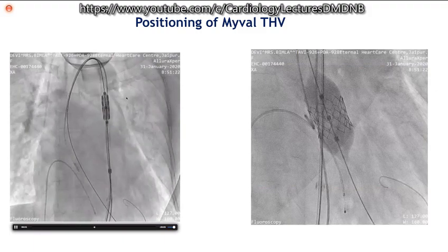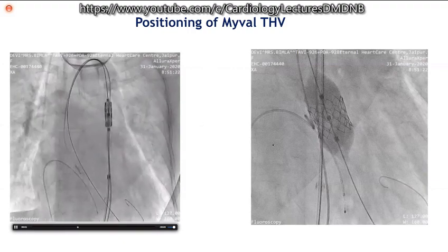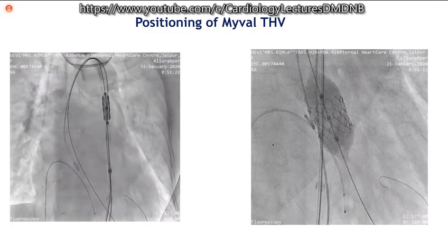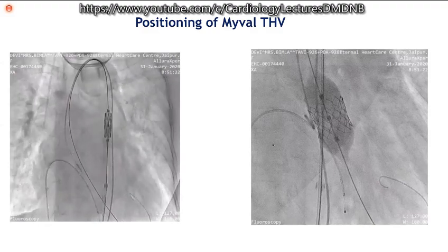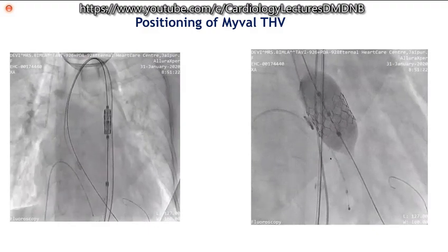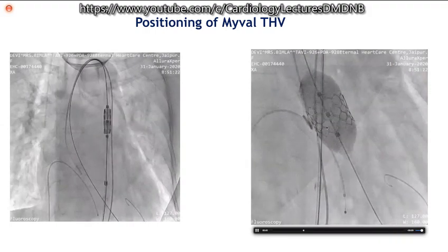This was already discussed in the previous cases as well. Use the Navigator system. So the way to position the Myval in pure aortic regurgitation is, you want to implant it a little deeper so that the anchoring starts from the LVOT till the level of the annulus. And the inflation is maintained slightly longer. So you can clearly see with the level of the pigtail, you can implant it a little deeper into the LVOT.